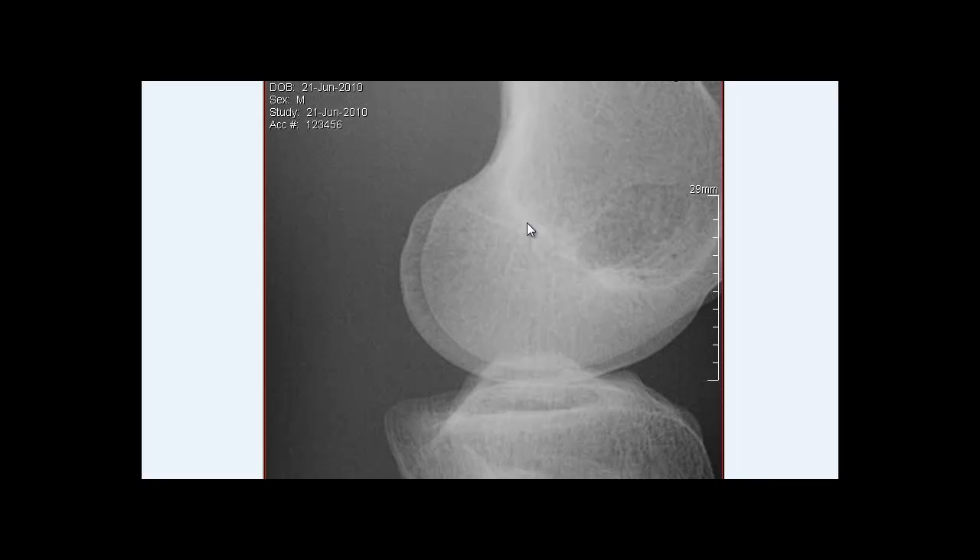We want to be able to repeat images without doing it multiple times. Everybody repeats — I do myself. But we need to learn how to look at an image, take the time to see what went wrong, and know how to correct it before exposing anyone again. A good technologist can do this well, because repeating unnecessarily is what we want to avoid. For this image, we're going to apply a five-degree cephalic tube angle to address the lack of superimposition, and rotate the leg externally just a little bit to bring the medial condyle over to superimpose the lateral condyle.